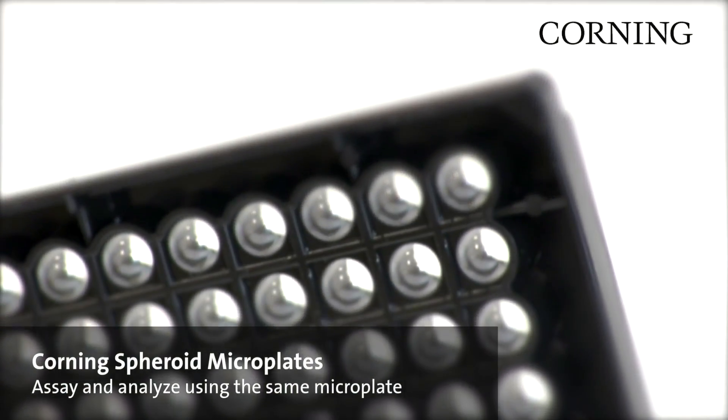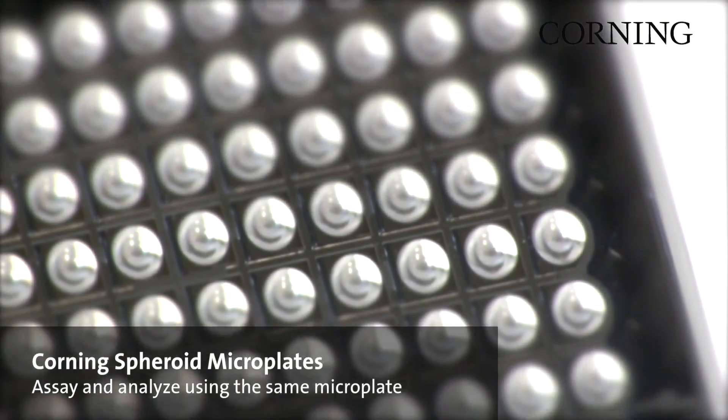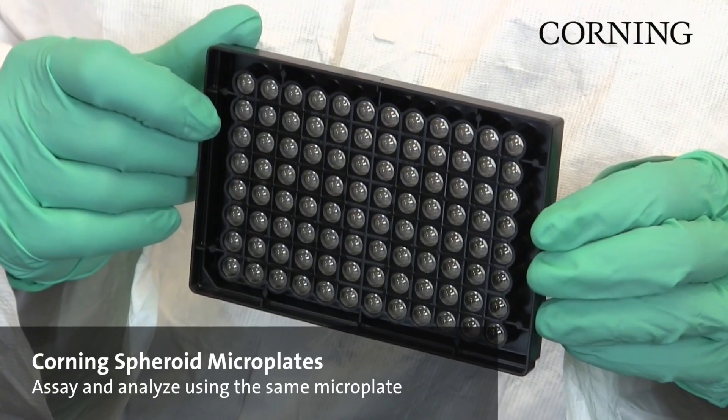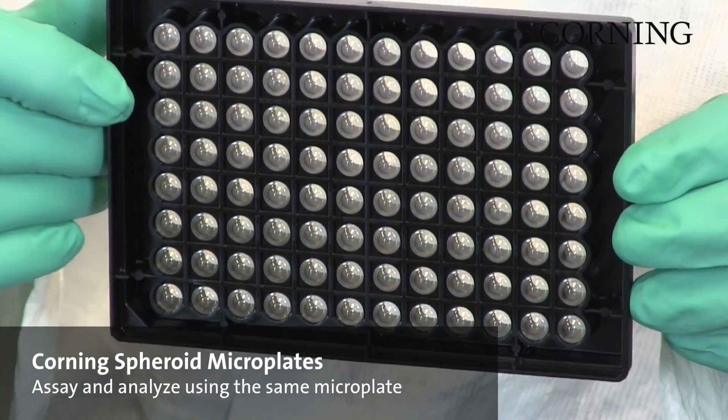Corning spheroid microplates simplify the process for growing 3D multicellular spheroids and embryoid bodies. Our spheroid microplates feature clear wells with a round bottom to make sample monitoring simple.